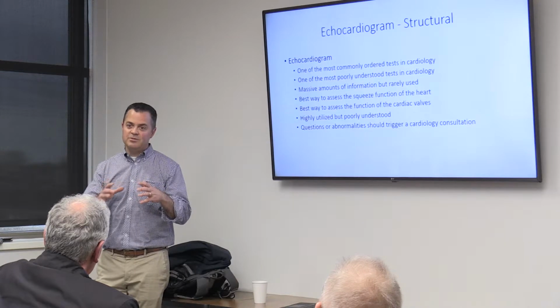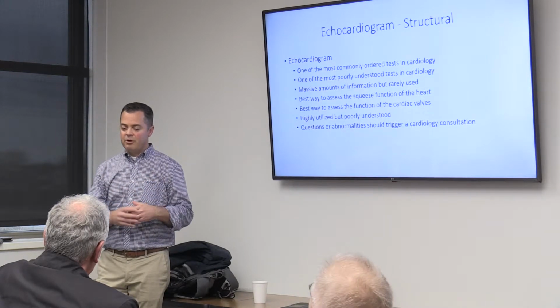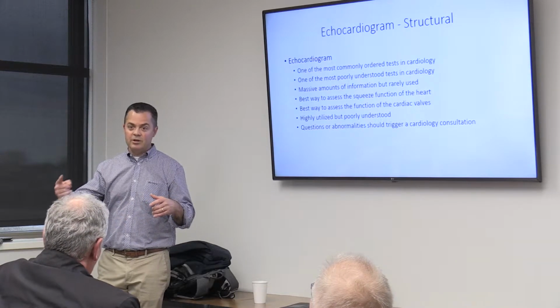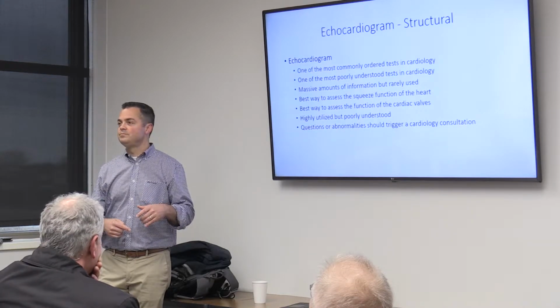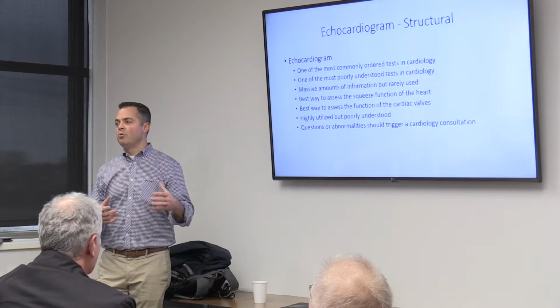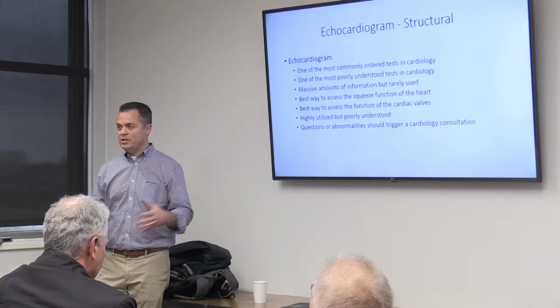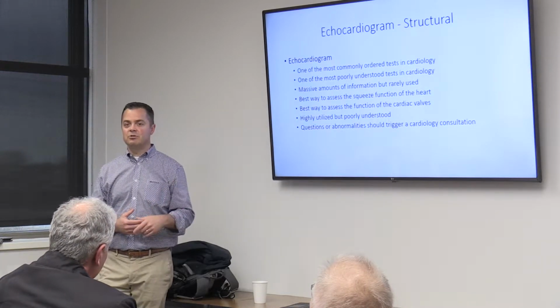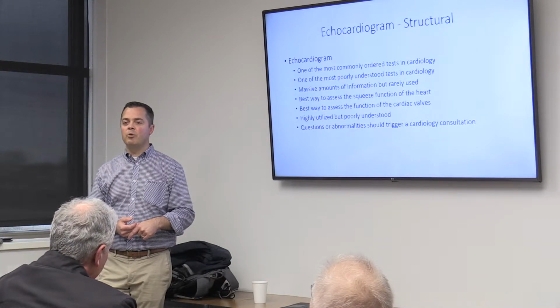That's what he's asking about, this number that we measure. There are some objective things we do, but there's also the eyeball test that we look at. And for somebody who's looked at thousands of these, you get good at it. So in general, a normal systolic or squeeze function of your heart would be an ejection fraction 55% or greater. Less than that, we would start to call abnormal.